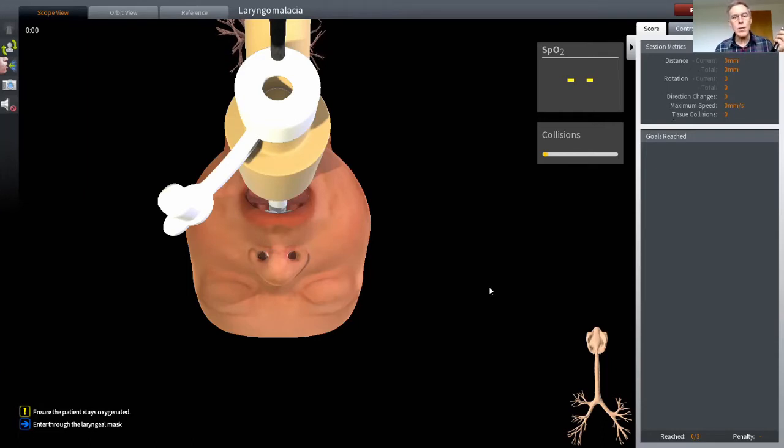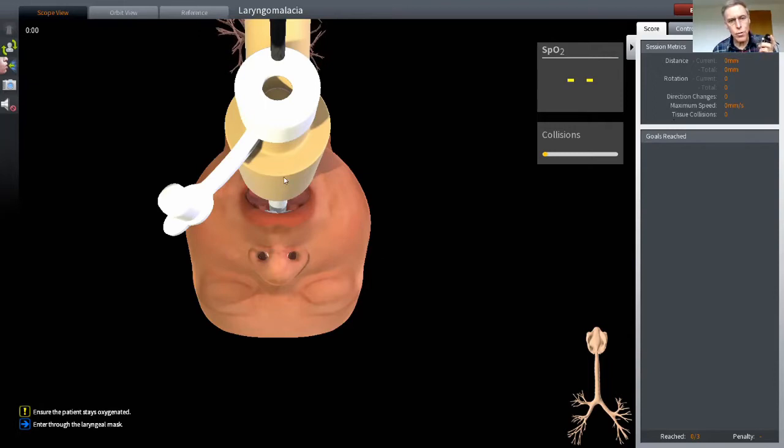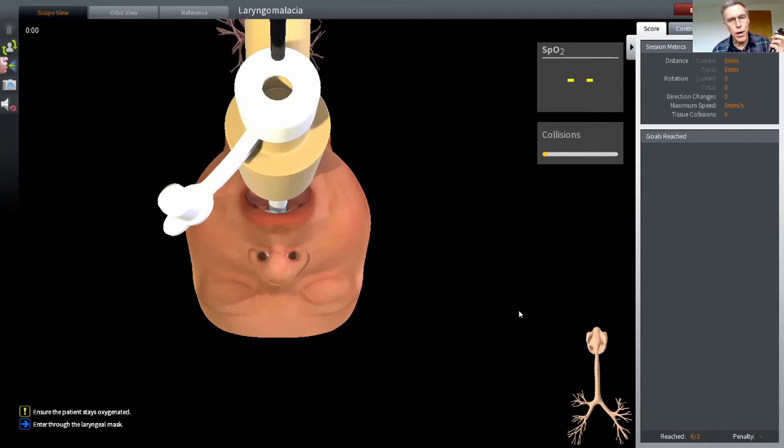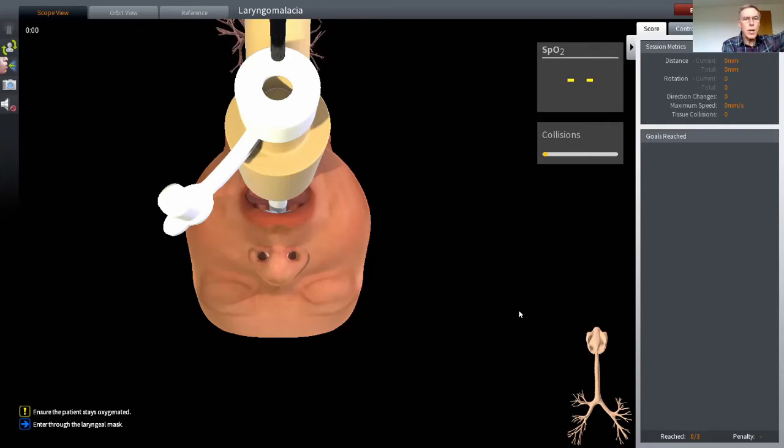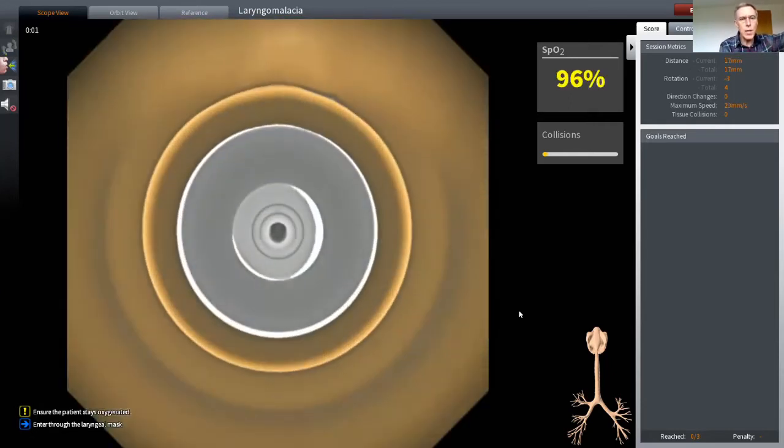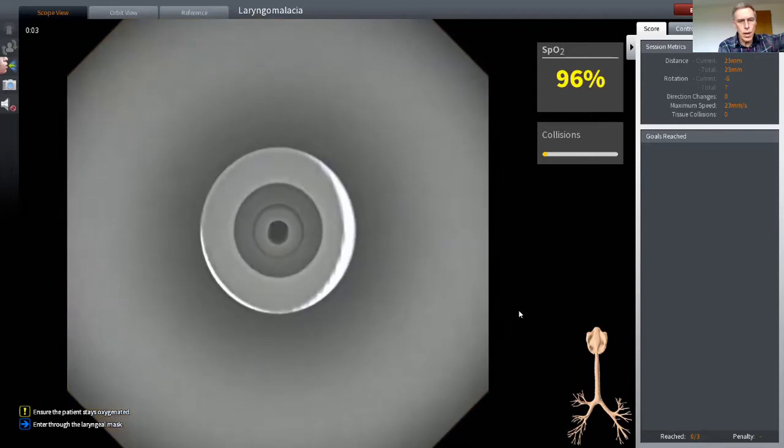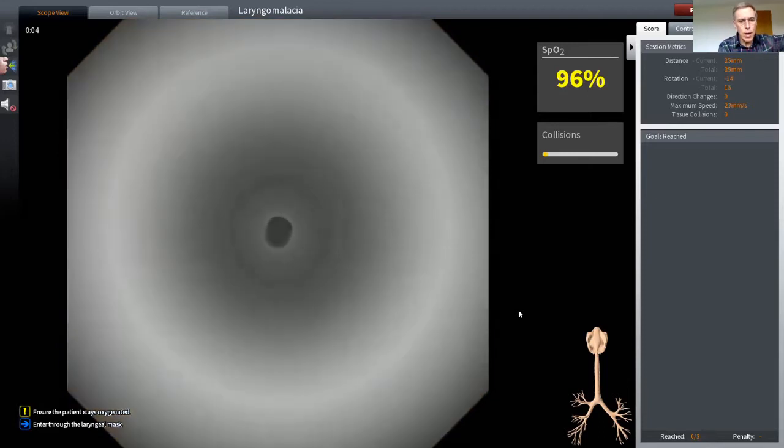Now, you can see this baby already has a supraglottic airway placed in their airway, and that's sitting from the mouth down towards the larynx with the opening just above the vocal cords. At the proximal end is a swivel connector. That's that yellow device, and it has a diaphragm with a hole through which I'm going to introduce the bronchoscope. So here we go. We're going into the swivel connector, and now I'm inside the supraglottic airway moving down towards the distal end.